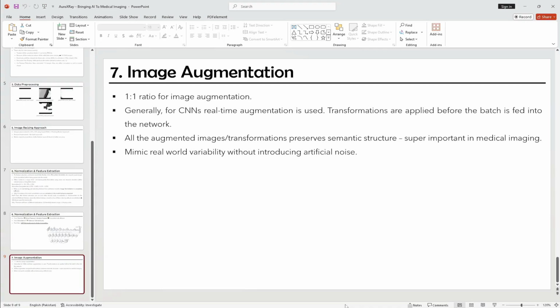On every batch, for example if the batch size is 64 or 32, it randomly applies transformations such as warping, rotation, scaling, etc. So even if you train for 5 or 10 epochs, your model might never see the exact same image twice. You can call that real-time augmentation.